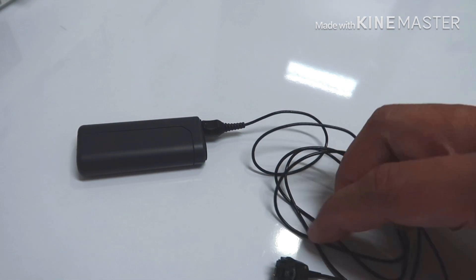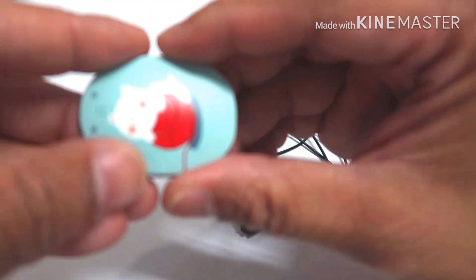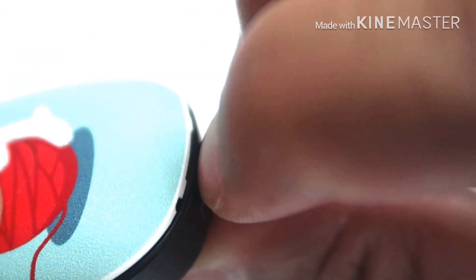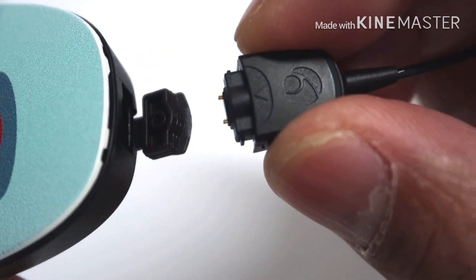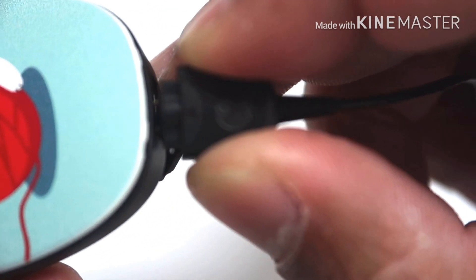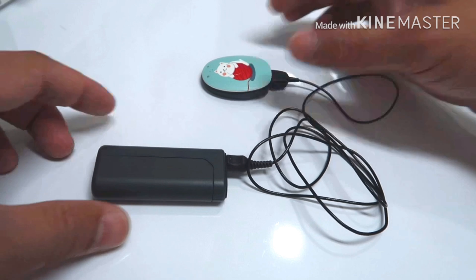Now, to connect the cable to your Rondo 2 audio processor, take your Rondo 2 audio processor and locate the rubber gasket behind your audio processor. Slowly remove it, and clip on your Rondo 2 mini battery pack cable.